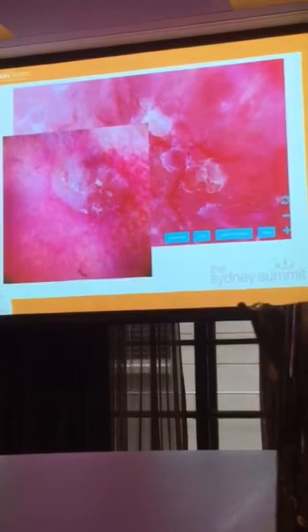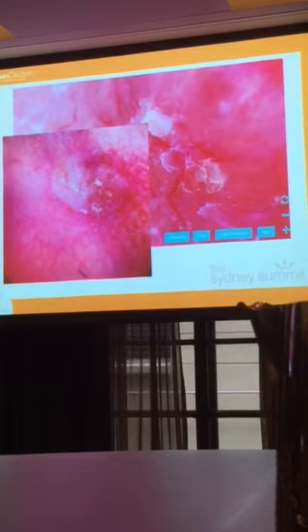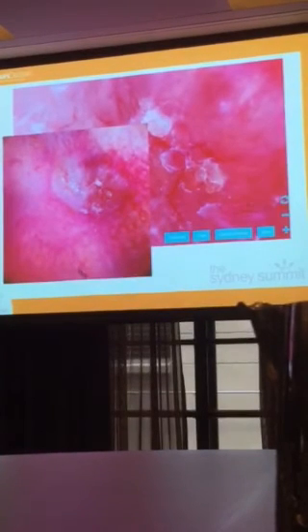And it's picked up beautifully by Dermage. We want to zoom in. That's the original photograph, and you can zoom right into this basal cell cancer and look at the finest little detail. Not that you need to, but it's impressive nonetheless. Dermage works, but there's human error involved in all of this. So there's the vasculature. You can zoom right into that basal cell cancer.